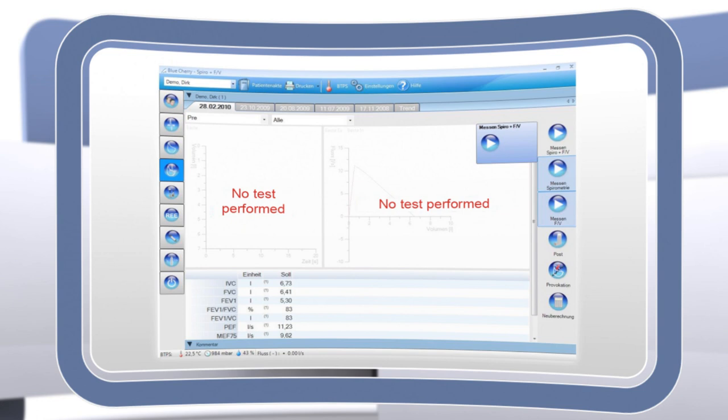The so-called flow volume curves appear later in the diagram area over here. The predefined parameter list shows the target value calculated by BlueCherry for the selected patients.